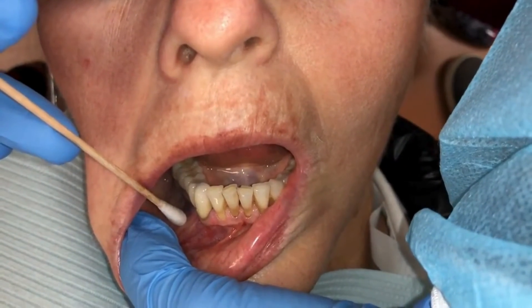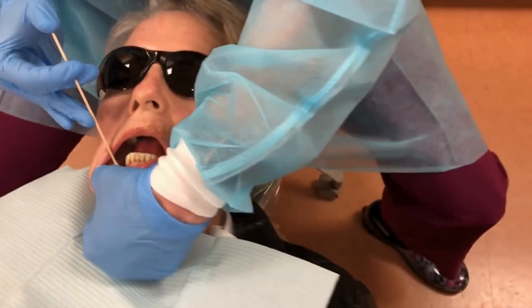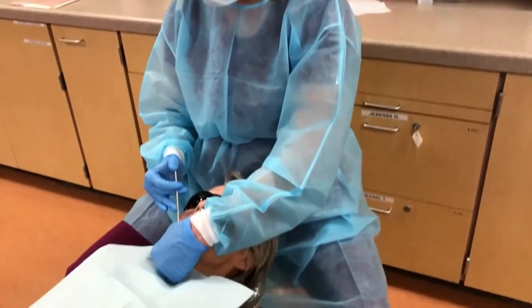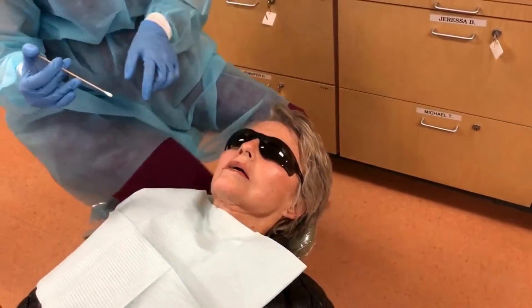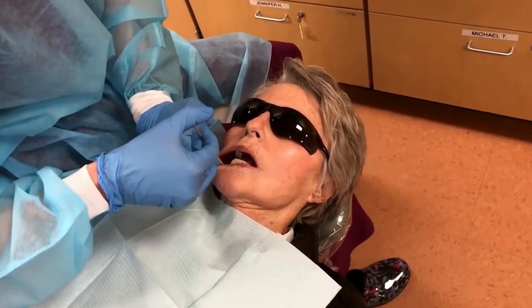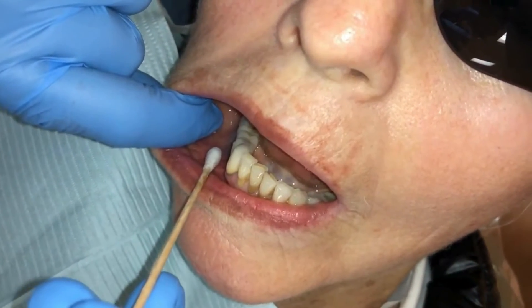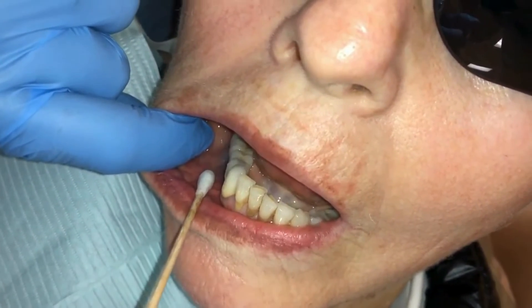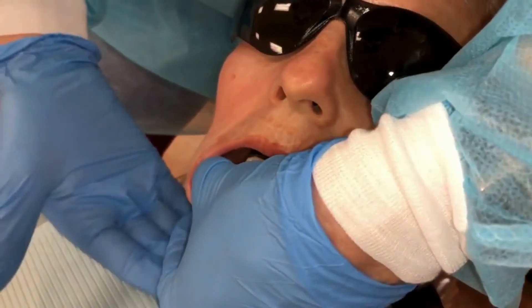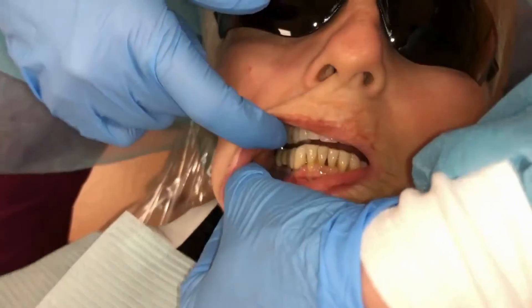It is important to keep the retraction thumb well out of the way. There are two options — both vertical, demonstrated first in the video, and horizontal, demonstrated second. The deposit site will still remain slightly superior to the mental foramen; the difference will be seating position. For a 12 o'clock vertical position, the clinician can utilize their thumb to retract the tissue downward and outward, utilizing the rest of the fingers to support the chin.